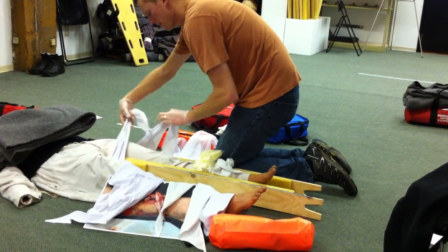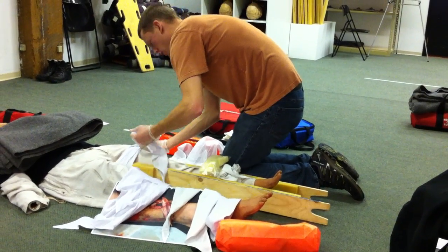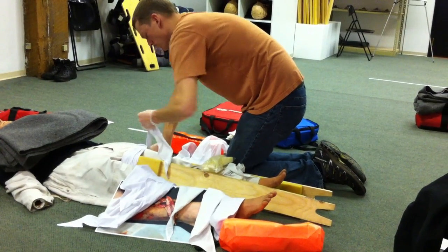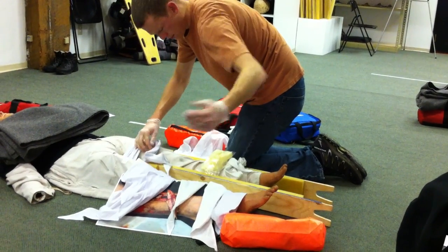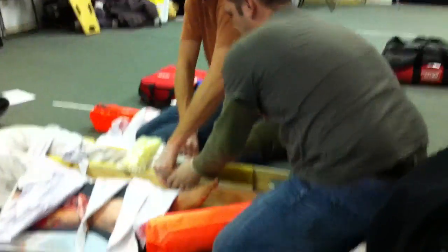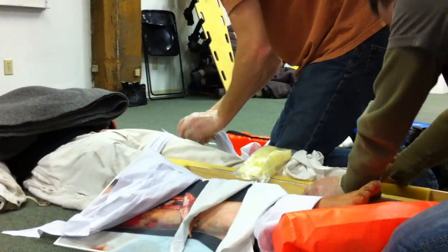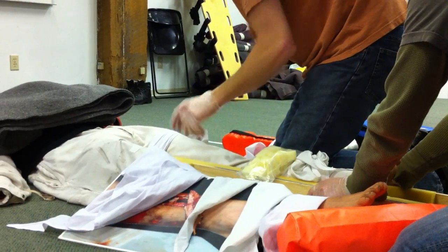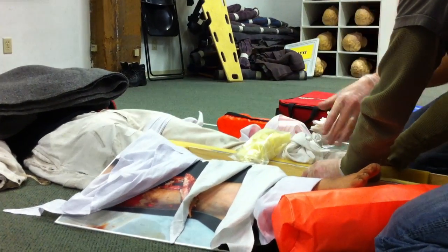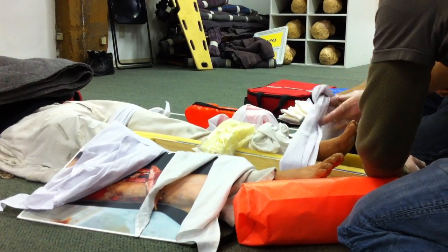Now I'm going to tie. So we started at the hip, which is the most stable, right? Exactly. Brian, do you want to come on here for just a second so you can help me out? We've got a helper in here, another helper. You just want to hold these so they don't twist on you when I tie. So we do the top, and then I come down to secure them so they don't flop all over the place, like we have Brian assisting with.